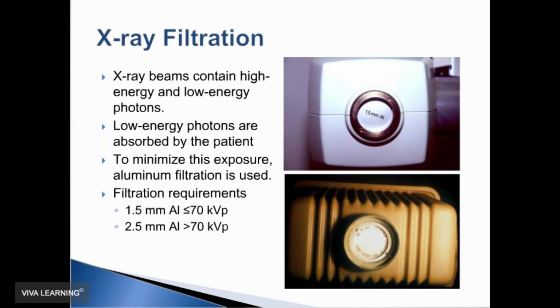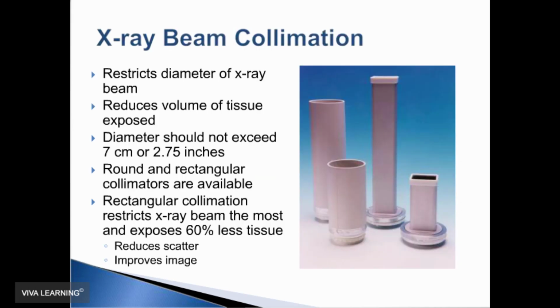Filtration and the amount of filtration that is required is dependent on the kilovoltage set on the machine. More filtration is required for machines at higher kilovoltage settings with higher penetrating X-rays. This feature of X-ray filtration is one aspect or factor that your X-ray machine inspector would take a look at to make sure it is optimal. Filtration is required by statute to be at the levels that you see on the screen.